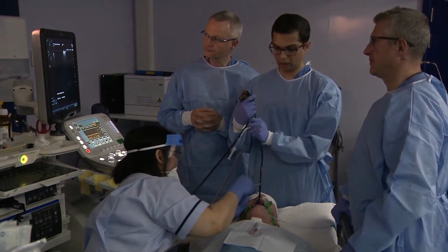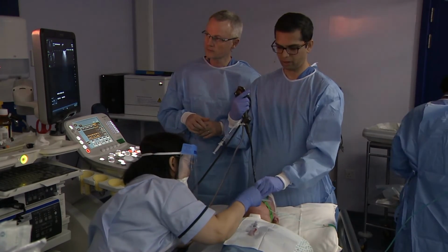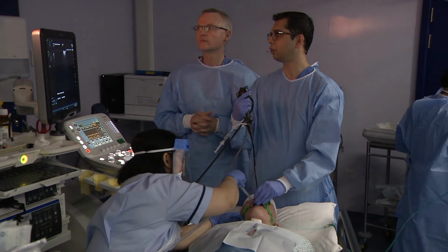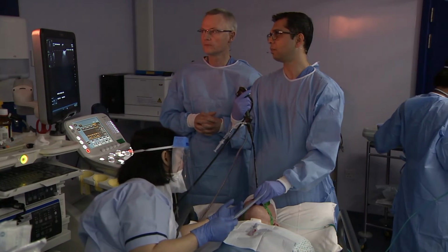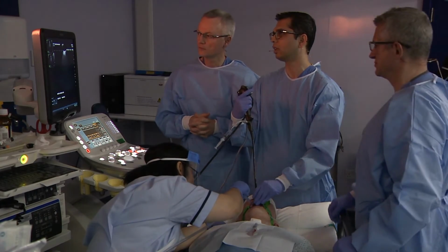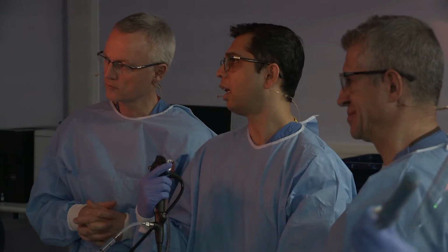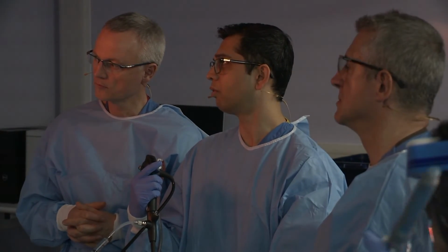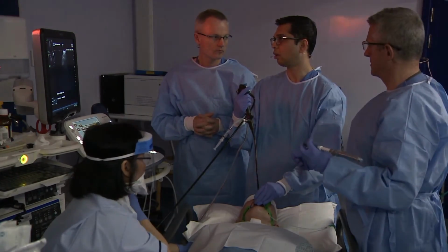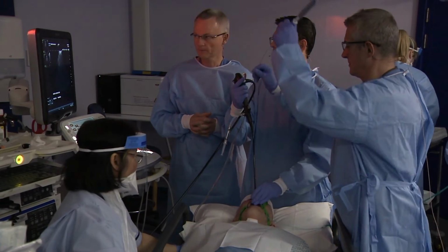Okay. So coming back to our landmarks again on the right hand side. You start with station 7 from the right hand side. So you go down in the right main bronchus, just below the carina, you turn anti-clockwise 90 degrees at 9 o'clock, and that's station 7 from the right. Then you come back in the right main bronchus, and just before the origin of the right upper lobe bronchus, you turn 90 degrees clockwise at 3 o'clock position. That's for station 10R.